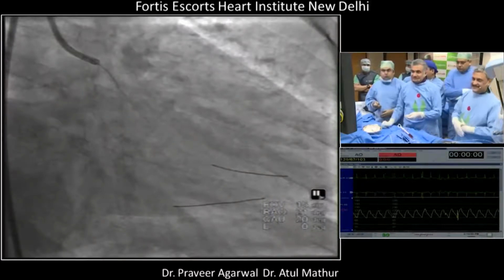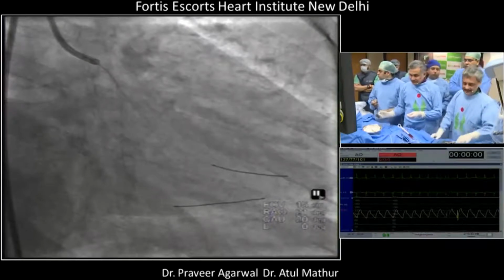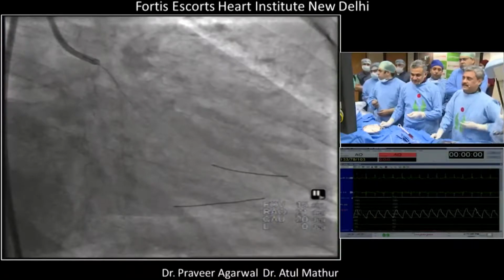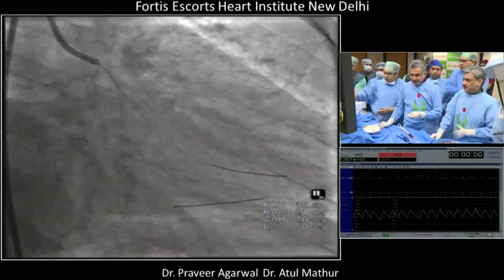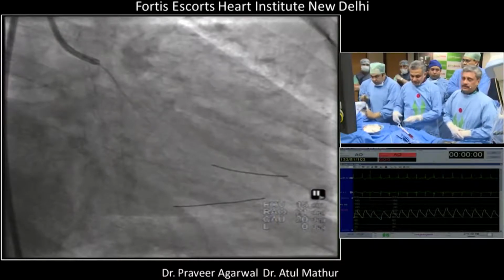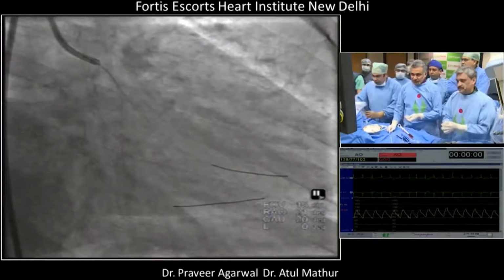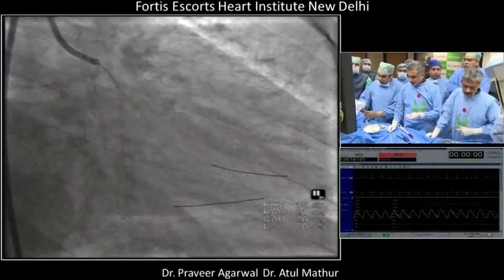Right. I don't know, is the OM large enough to accommodate a 2.5 stent, and can you do IVUS? Yeah, it is. It looks like a 2.5. No, we have not done any intubation in this as of now. We didn't want to start doing any dilatation before we went live. Do you want an IVUS first, or should we dilate? Because I think IVUS would not go in the OM. Yeah, dilate is okay. And once we dilate it, maybe it's going to grow in size.